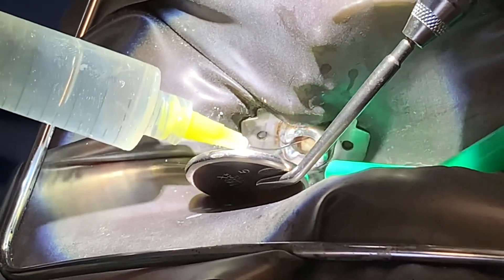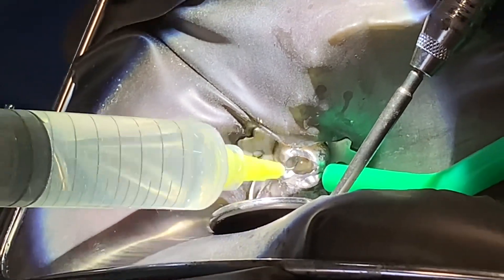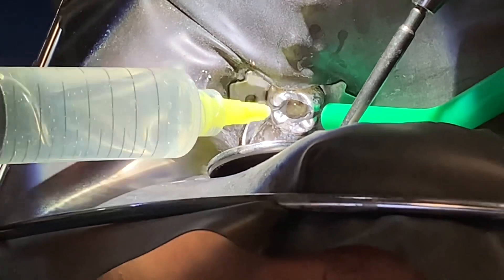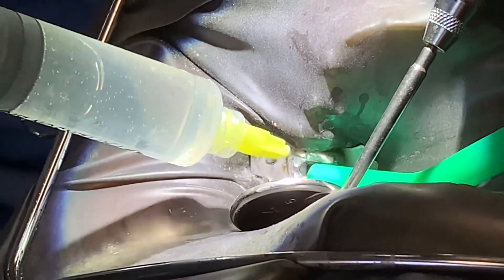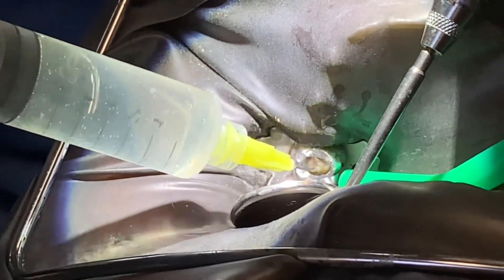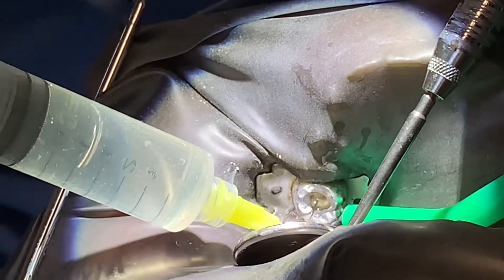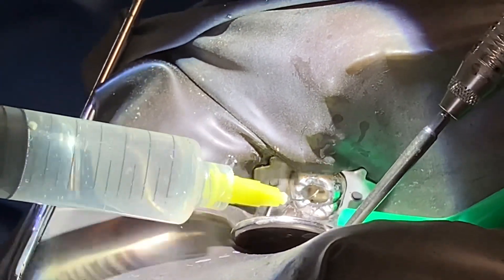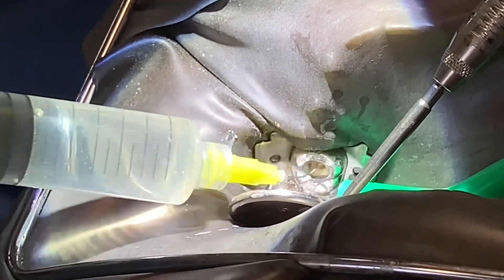So we're fighting biofilms that attach themselves to the canal walls. Sonic activation, ultrasonic activation, brushing — all of that will remove the biofilm from the canal walls and give us a better success rate overall. Everything hand in hand — fundamentals of endodontics.